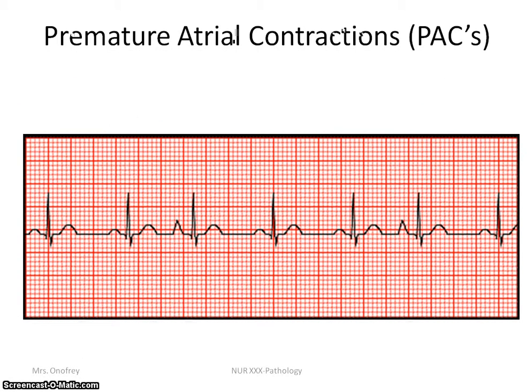With premature atrial contractions, the pacemaker cells are firing from somewhere within the atria and occur before the next expected beat should occur, as seen here. The rate is usually that of the underlying rhythm, in this case a sinus rhythm. The pacemaker site comes from somewhere within the atrium but outside the SA node. PACs occur as single ectopic beats or can be from multiple sites, called multifocal.